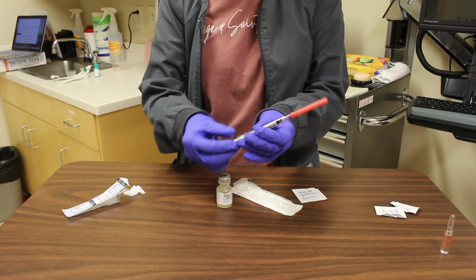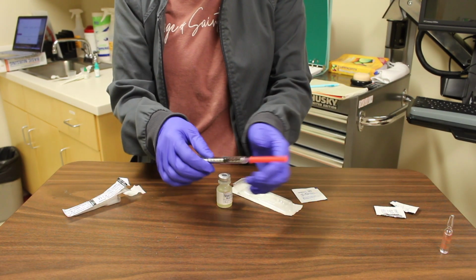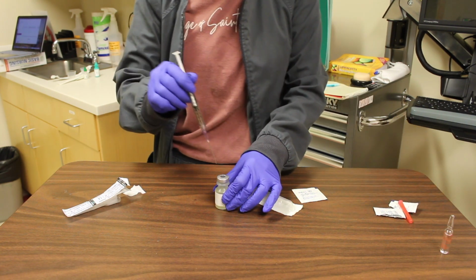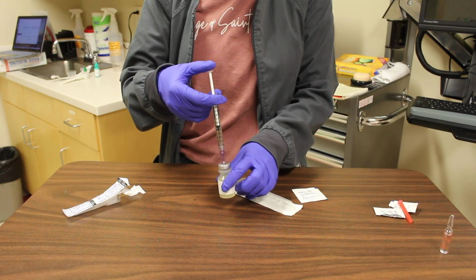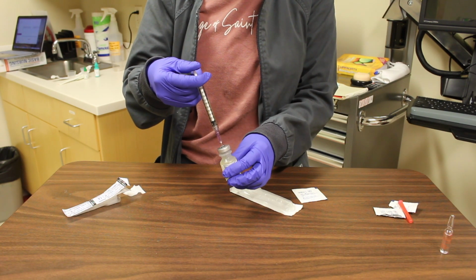Draw air into the syringe that is equal to the amount of medication that needs to be withdrawn from the vial. Remove the cap of the blunt needle carefully. Place this on a clean surface. Insert the blunt needle into the vial at a 90-degree angle while maintaining sterile technique. Inject the air from the syringe into the vial with the tip of the blunt needle above the fluid line.